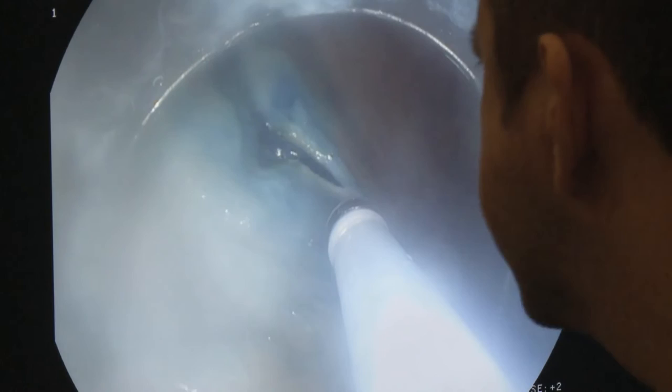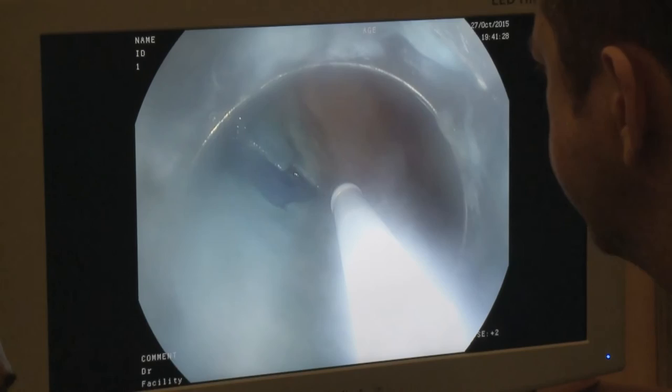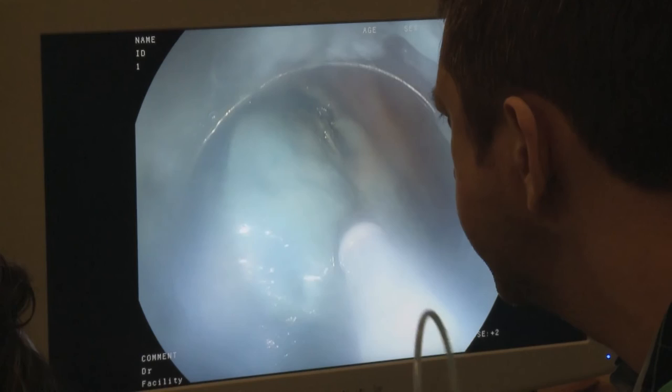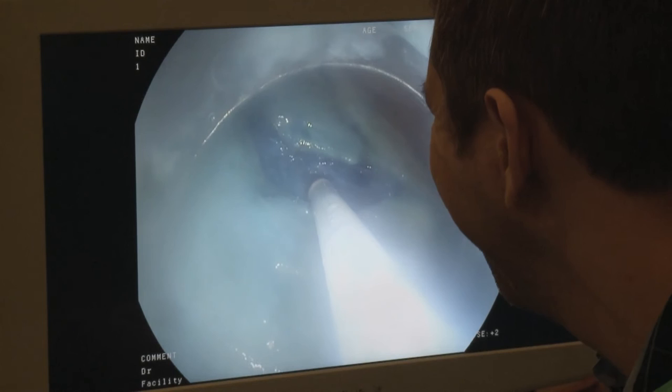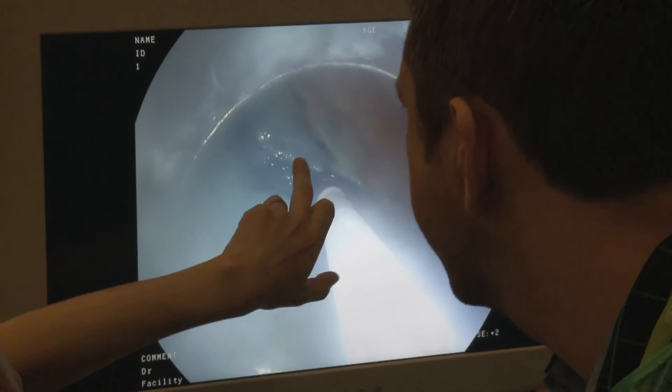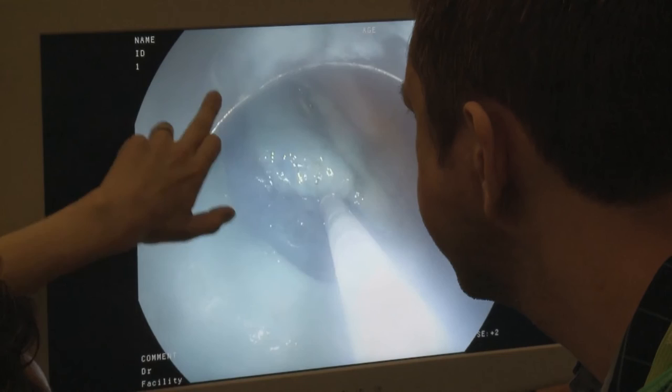And dissect from the proximal to distal dissection, but inject more fluid, here, inside, outside. Now you have to go under it. Inject fluid, lift it up, and then go under it. You don't have time to lift. Here, just under the mucosa. From here, here. That's okay, that's okay.